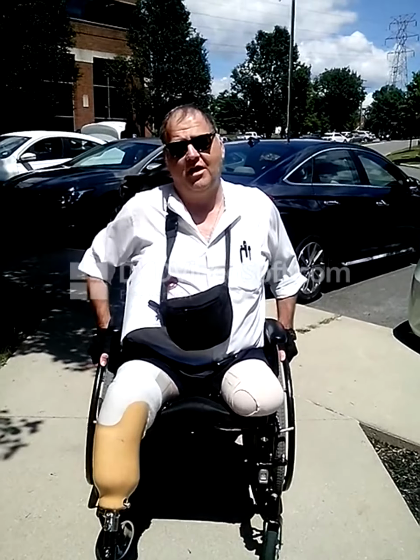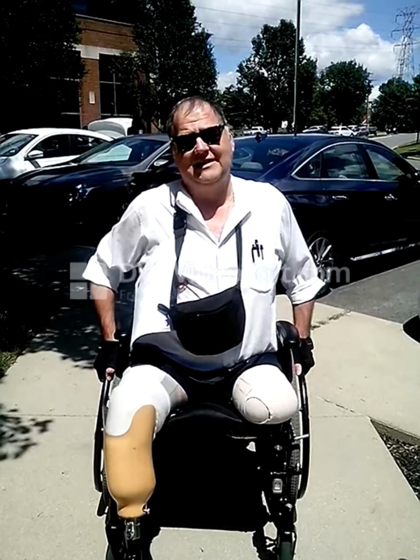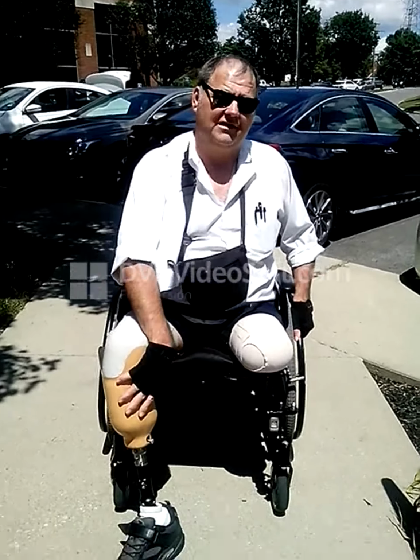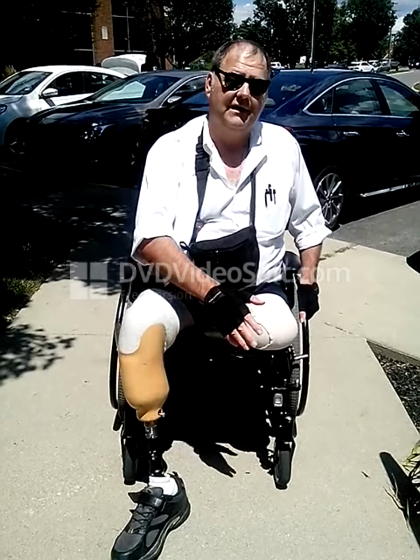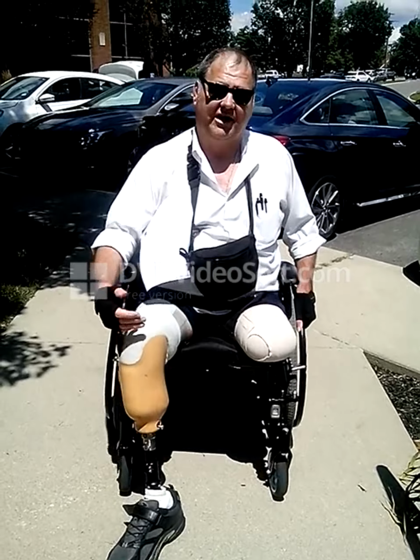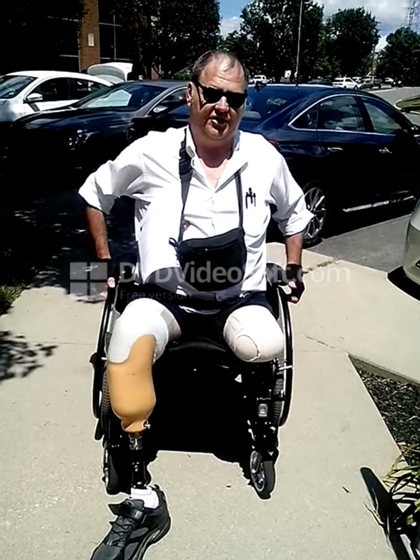Now the question was just posed, how do I get down a ramp? I simply go down a ramp. When I'm in this configuration, it's really simple. I have one prosthetic on. I don't have my other one on for other reasons, but I have a prosthetic on so I can use this as a brake to a certain extent.